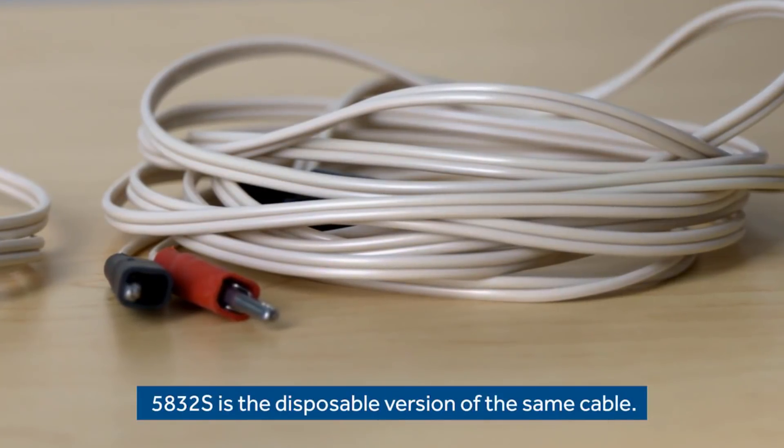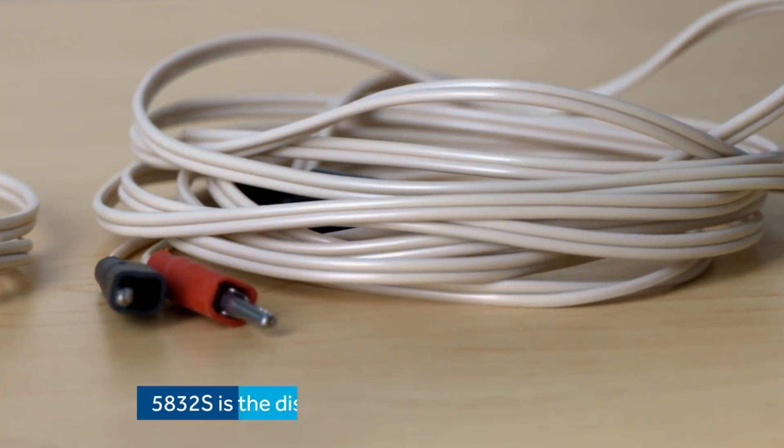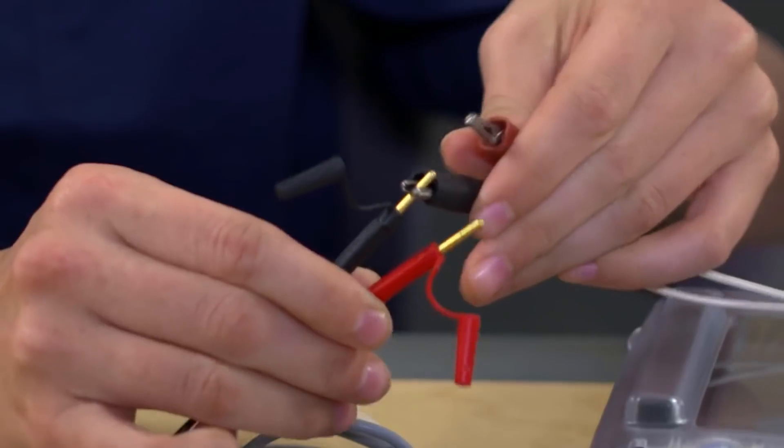One more cable to show you today is the 5832S. This one has alligator clips and is typically used during surgery — these clip onto the lead. Do you know where to place the cable ends? To be consistent with the others, I suspect that black connects to the negative pin and red to the positive.